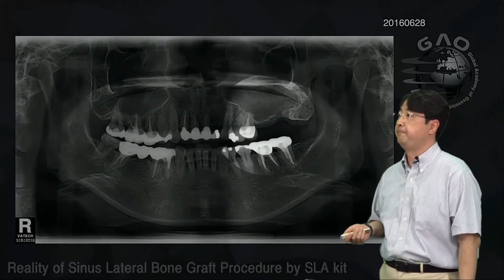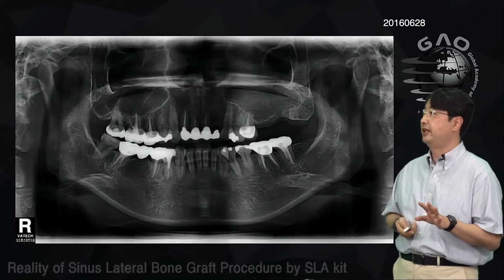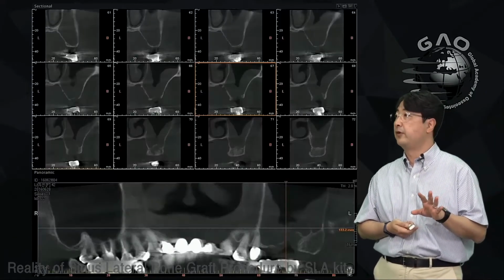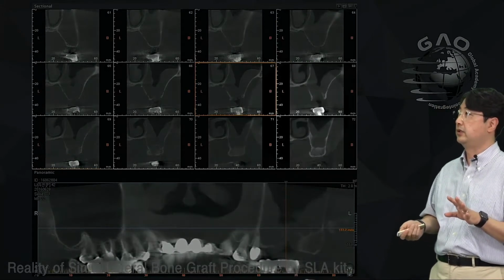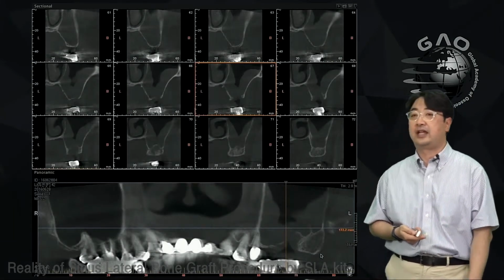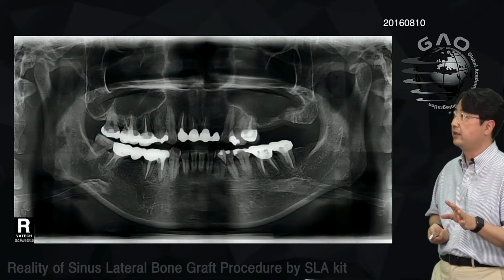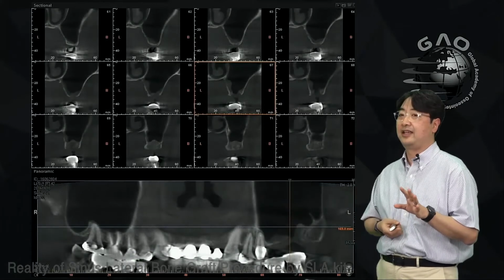This patient needs some bone graft and sinus graft for the left posterior maxilla, right? But here you see the heaviness on the left posterior maxilla, the left maxillary sinus. From the CT scan, you can see the membrane swelling, the thickening of the sinus membrane on the left side. So I told her to go to the ENT doctor, and she had medication for a couple of months. Then she came back.